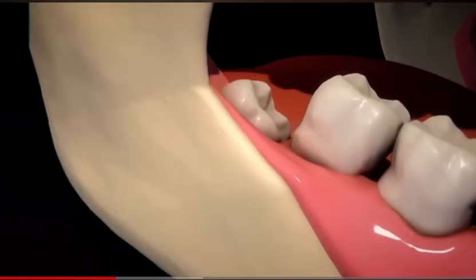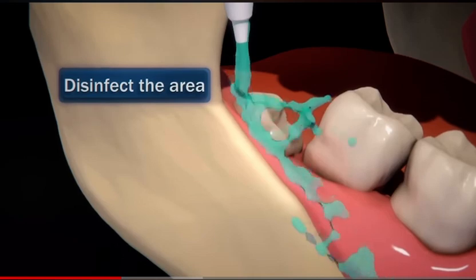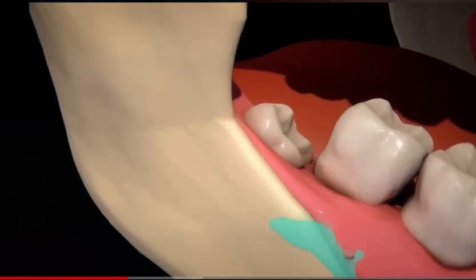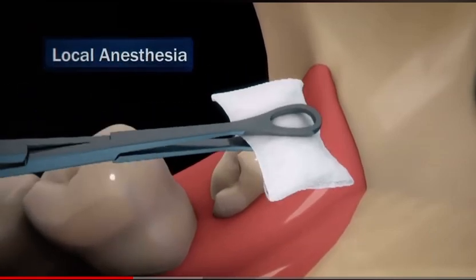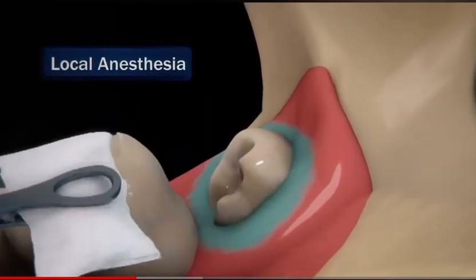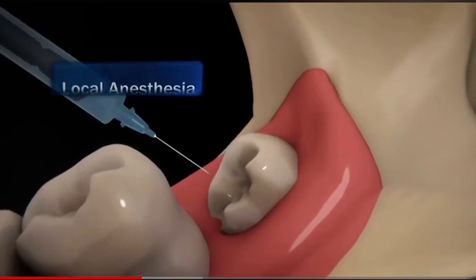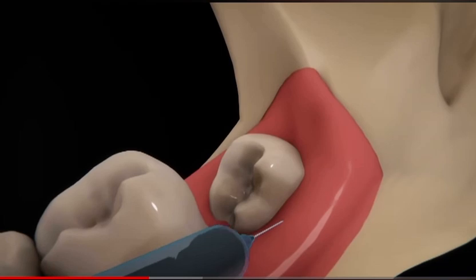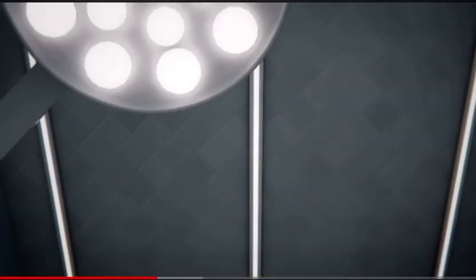Once the x-ray has been analyzed, the specialist will disinfect the area with an antiseptic or mouthwash and decide the type of anesthetic to apply. If the specialist decides to use local anesthesia, they will first place a substance on the gums to numb them and then apply one or more injections near the extraction area so that the patient does not feel pain during the procedure. The patient will remain awake the entire time.